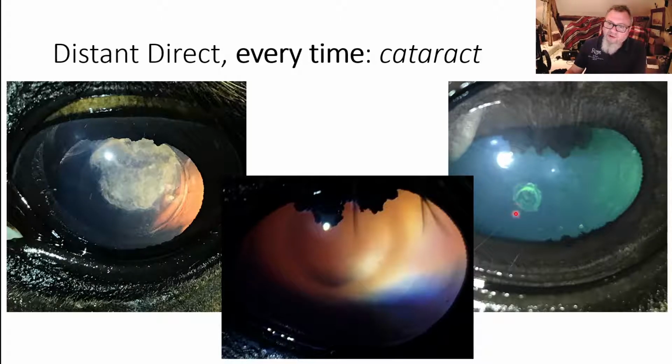And there's a small focal cataract at the front of this patient's lens here. So when you have cataracts or opacities at the level of the pupil, this is just beneath the anterior lens capsule, so it's at the level of the pupil. What you'll notice is as you move around, this opacity will remain in the same relative position to the pupil margin. Whereas this is a nuclear cataract, so further away from the pupil, and as you move around, you'll see this opacity will change position relative to the pupil.